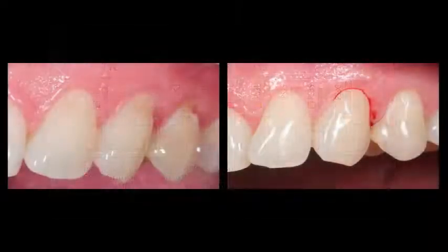And here's our final view, the before version of the erosion or abrasion lesions, whatever you want to call them, and then the finished product, the finished restorations.